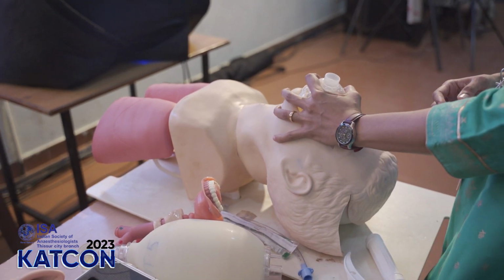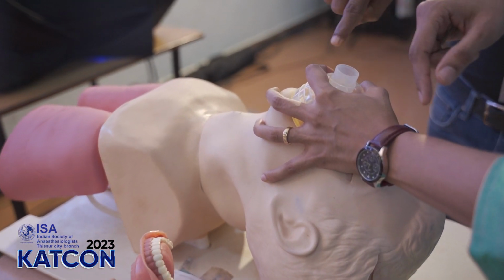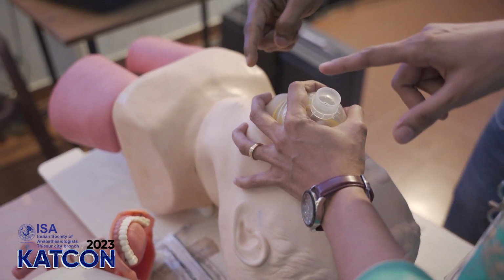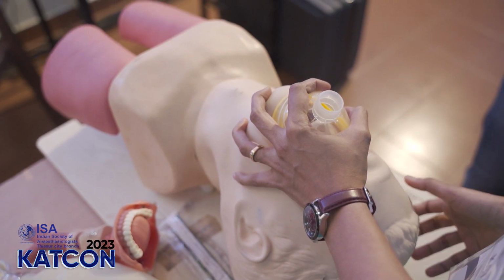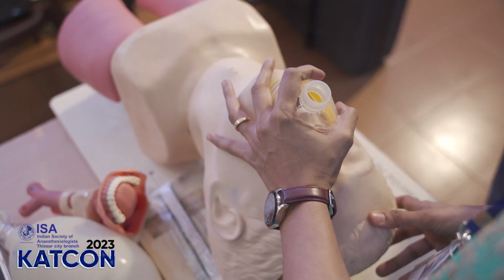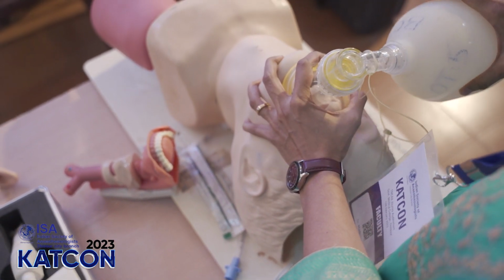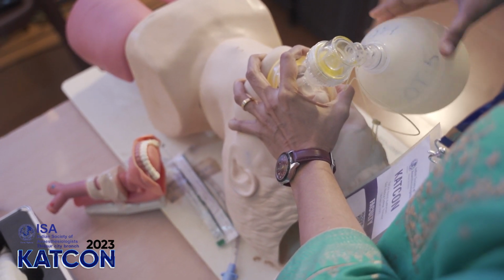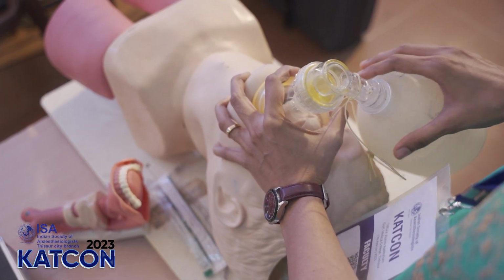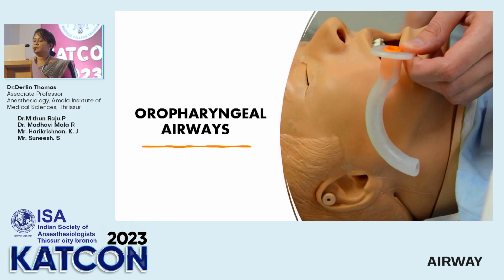Now she's showing the way one should hold the mask. That is the CE technique. This is the C part, the index finger and thumb. Then the other three fingers form the E. Understood? This is how you hold a mask. This is how you ventilate with a mask. She's using a self-inflating bag to ventilate now. In most OTs, we have the Mapleson circuit or the closed circuit, which has bags, and you can use those bags to ventilate the patient. And this is the Guedel's oropharyngeal airway.